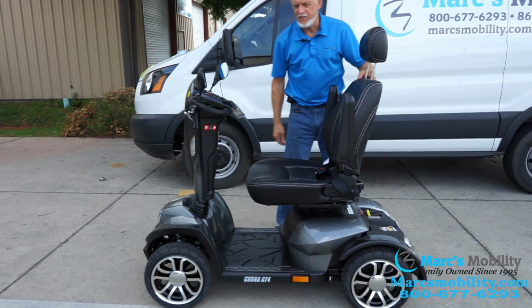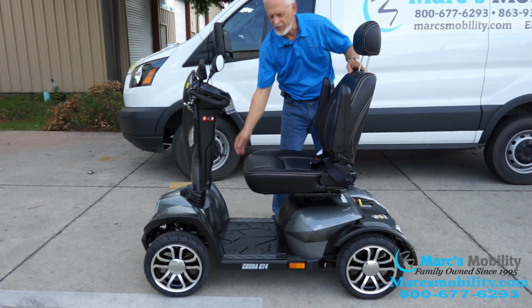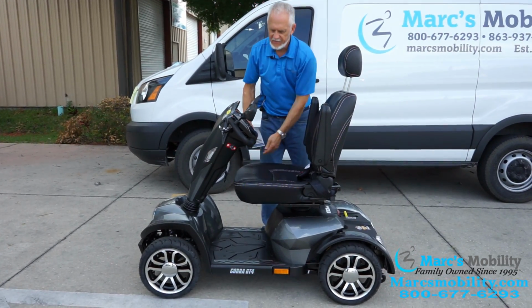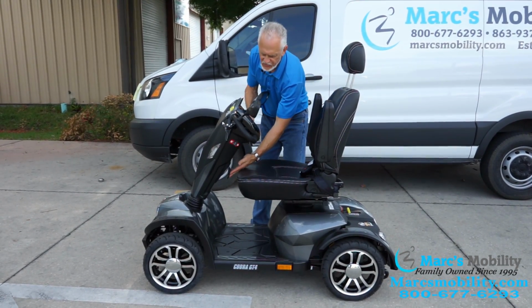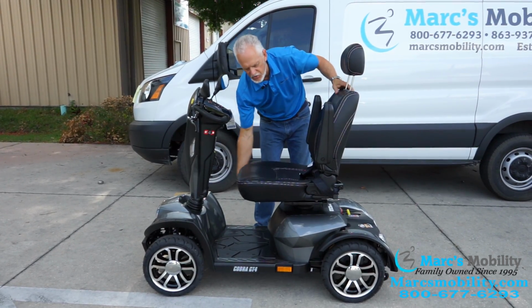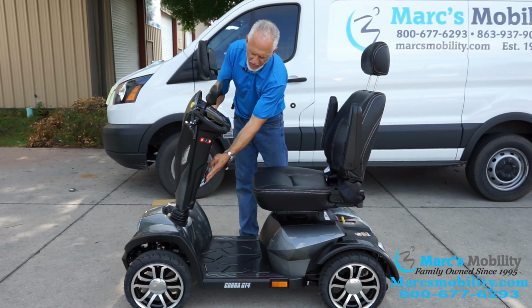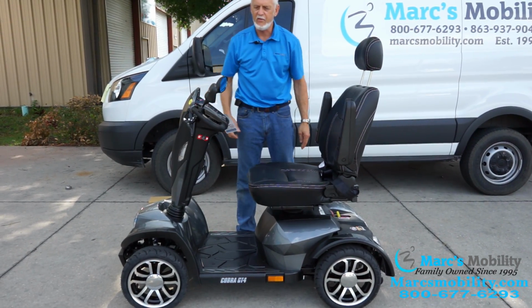This is as close as the seat will come if the tiller's this far. And if you bring the tiller down, this is what you're looking at. These are just options I'm giving you in case you have questions. So with the seat all the way back and the tiller right here is about normal position for driving.